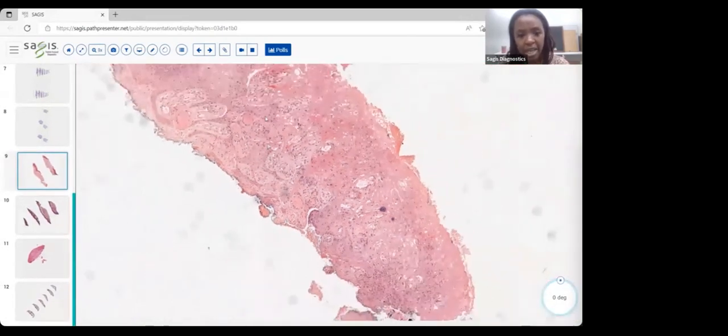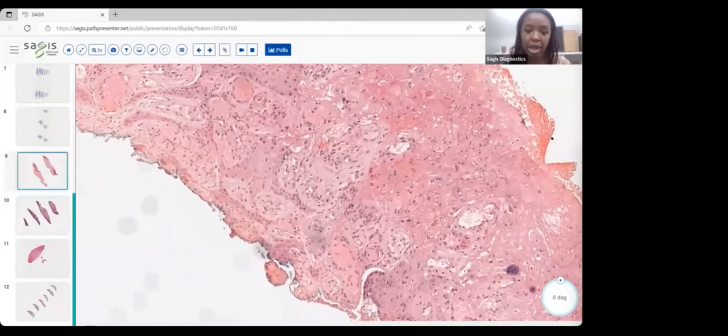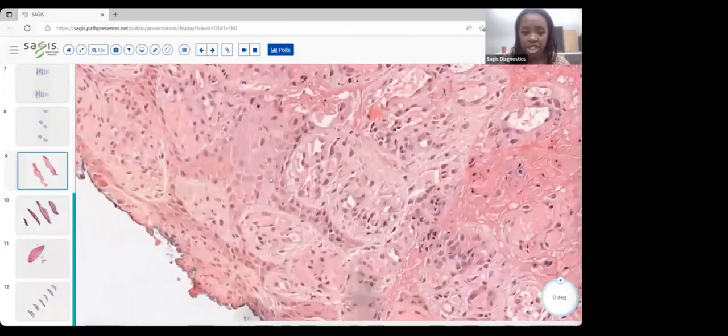You have this kind of reticulation of the strands of epidermis that are left behind as the epidermal cells, the keratinocytes, fill up with fluid and develop edema, and there's edema outside, and then they burst. So that's how the epidermis is breaking down. But the ones that are remaining intact, they're remaining intact in this kind of stranding pattern that almost seems like it's creeping down. So this is reticular degeneration.